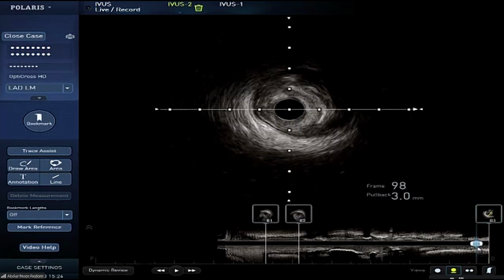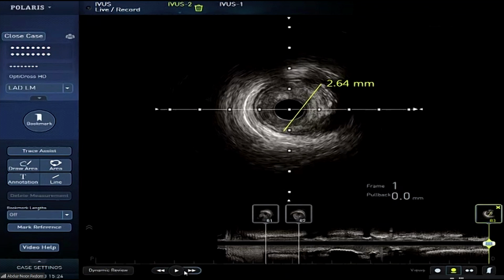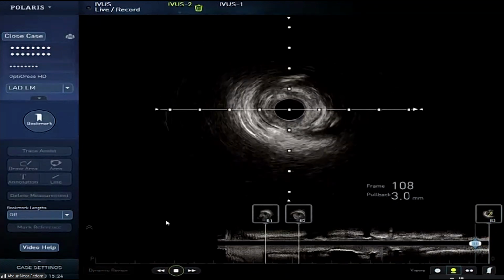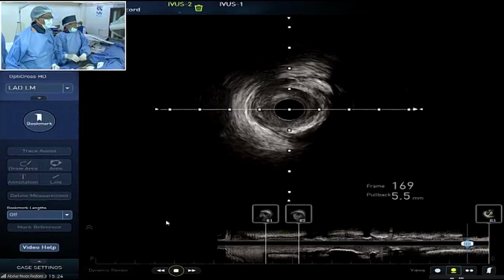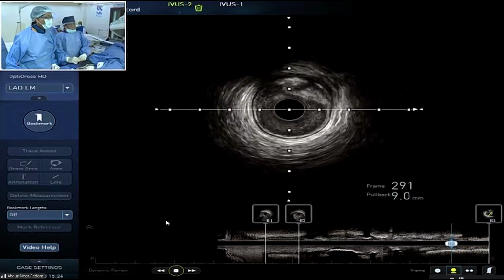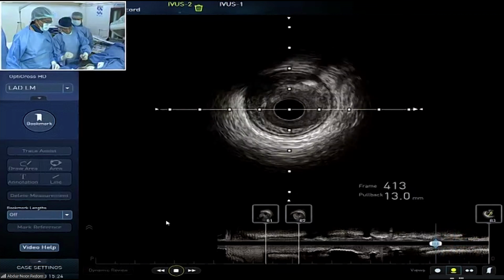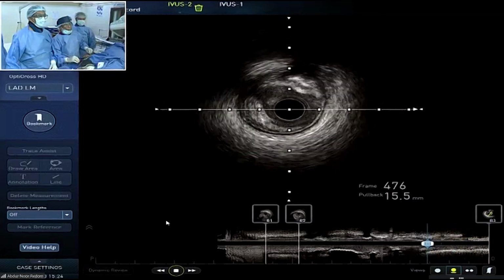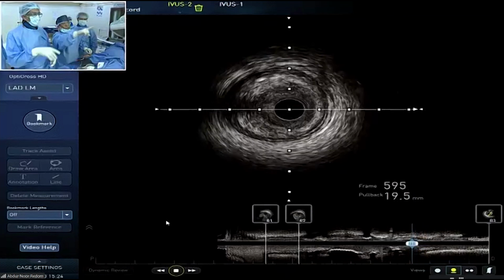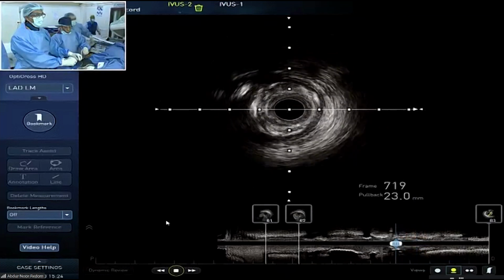So let me ask one question, Mirzaul sir. Is it a balloon undilatable lesion or a balloon uncrossable lesion? Previously it was a balloon uncrossable lesion. Ramesh, what do you think actually? What is your strategy, to go for IVUS first, then you can make a plan? That's exactly right. I think this is a balloon uncrossable lesion. Yeah, the pressure, we need to give something.